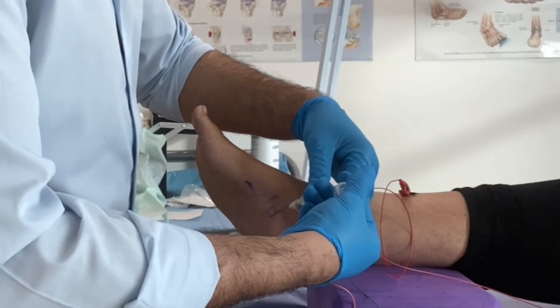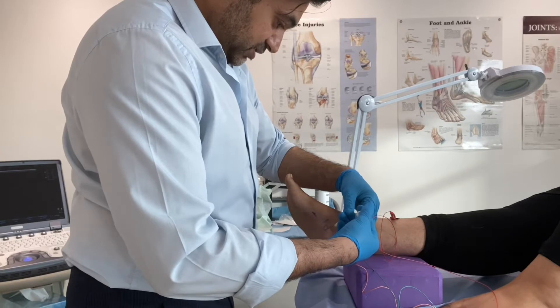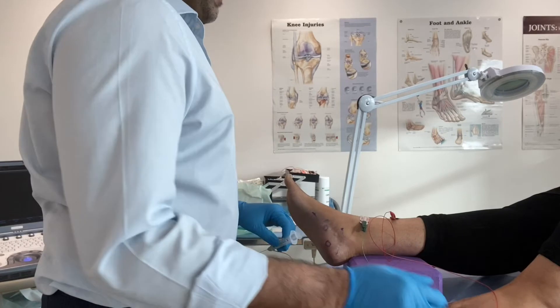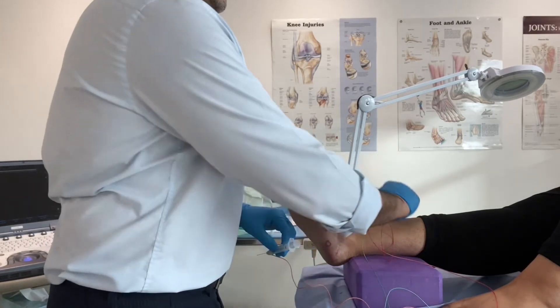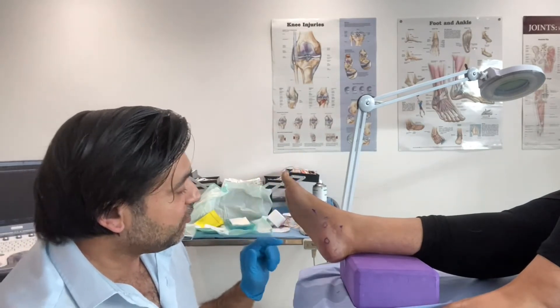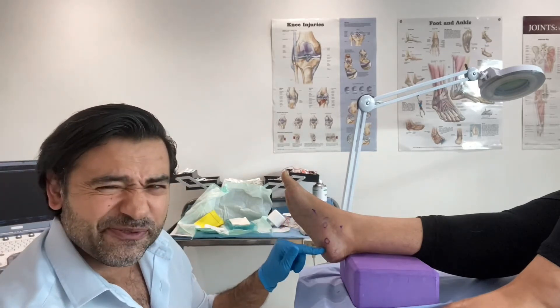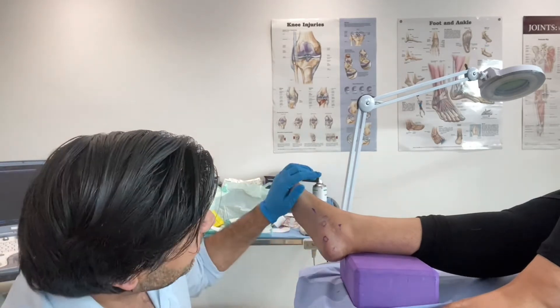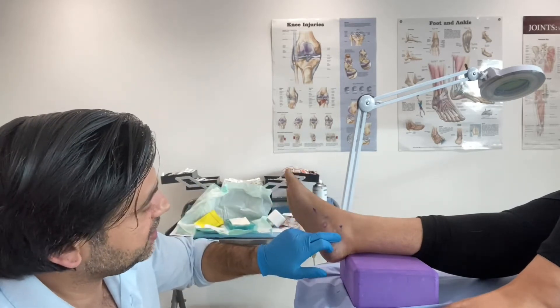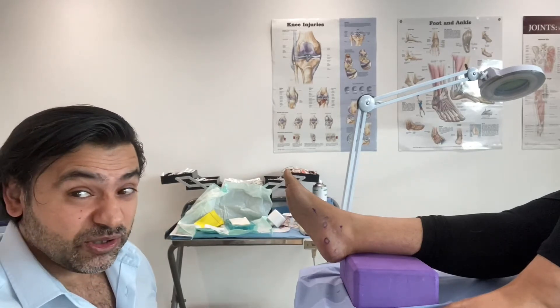So you're doing really well, nearly finished. That's the first of two injections done. How are you feeling? How was the first one? Now, before I do the plantar fascia injection, I'm going to do a tibial block so it's not so painful — otherwise it's very painful. We've marked the anatomy, so we know where the tibial artery is and we're going to inject posterior laterally and anesthetize the tibial nerve.